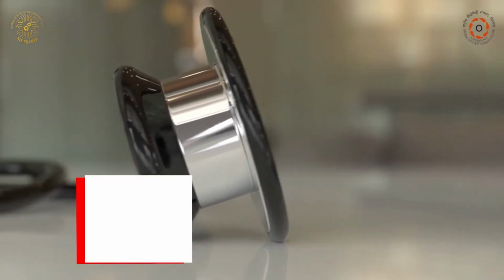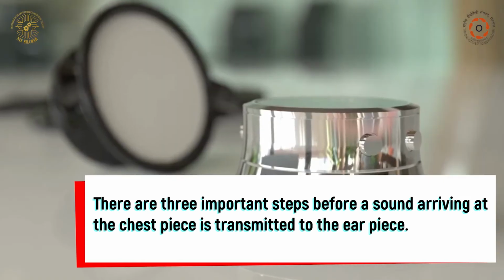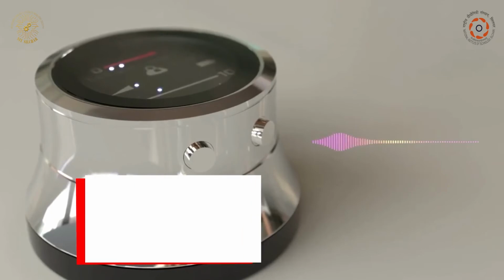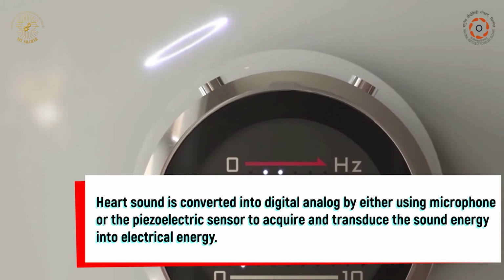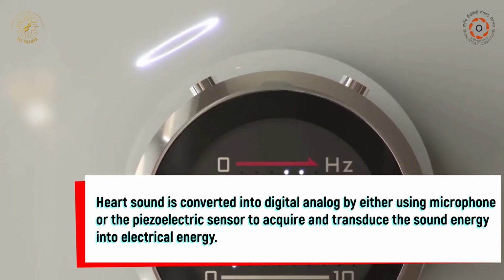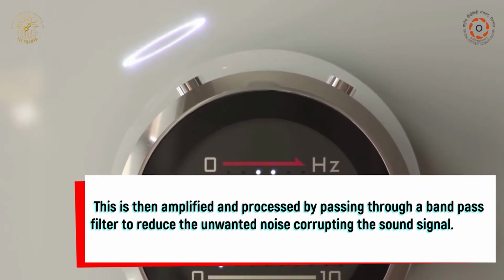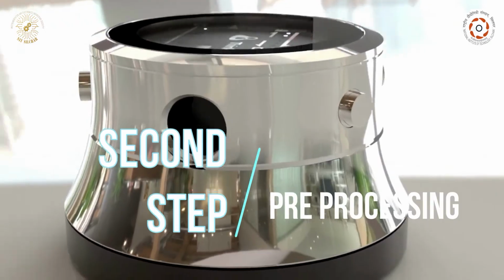There are three important steps before a sound arriving at the chest piece is transmitted to the earpiece, which we will be discussing. The first step is data acquisition. Here, heart sound is converted into a digital analog signal by using either a microphone or a piezoelectric sensor to acquire and transduce the sound energy into electrical energy. This is then amplified and processed by passing through a band pass filter to reduce the unwanted noise corrupting the sound signal.